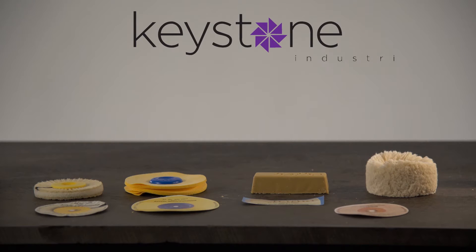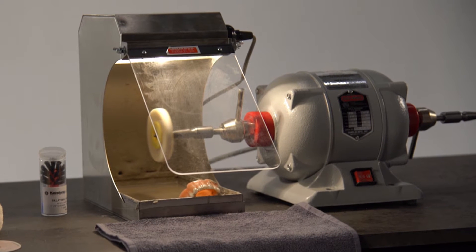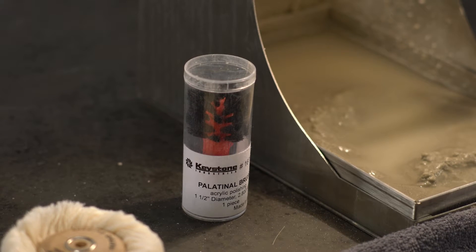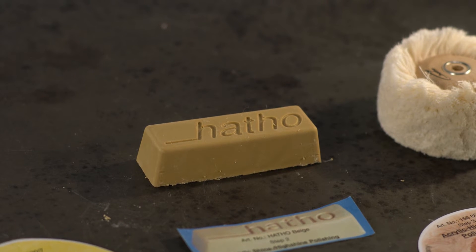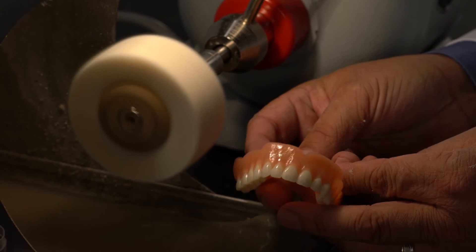The Acropole acrylic polishing kit from Hatho and Keystone Industries is the most efficient and fastest way to polish any type of acrylic denture based material. The Acropole system is a three-step polishing system which includes a pre-polishing buff and brush combination to be used with pumice or pumice-free material, a microfiber leather buff and polishing compound to bring about a base shine, and a cotton buff to produce a brilliant shine which will add beauty and a natural appearance to any denture.